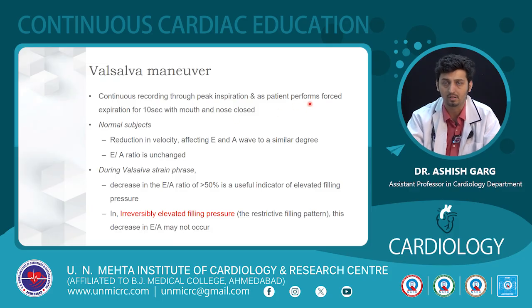Valsalva maneuver is used when there is a pseudo-normal kind of pattern, and what we do is we make the patient perform a forced expiration for 10 seconds with the mouth and nose closed. In normal subjects, there will be reduction in both the E and A velocity to a similar degree, and the E by A ratio is unchanged. If there is a decrease in the E by A ratio of more than 50%, it indicates elevated filling pressure.